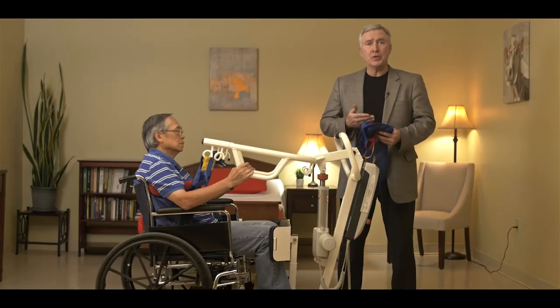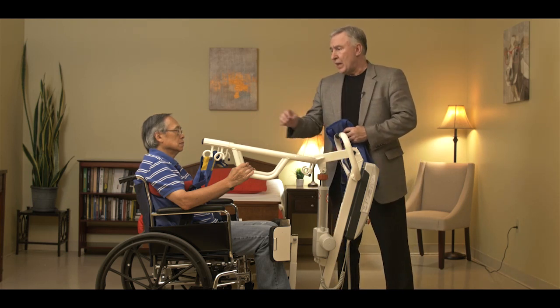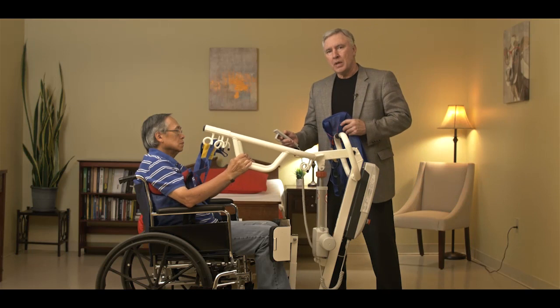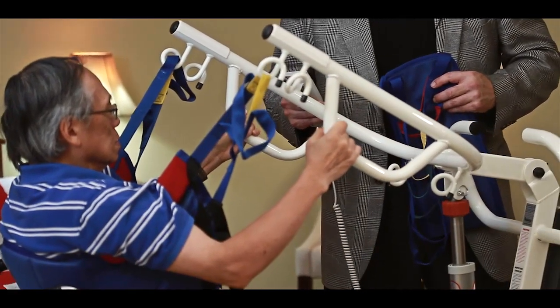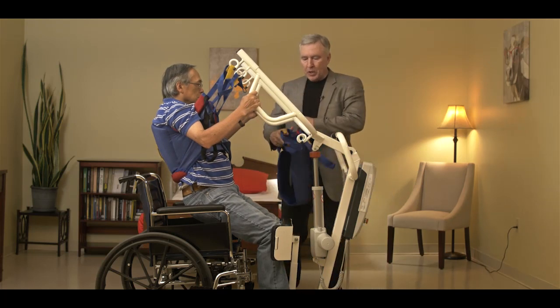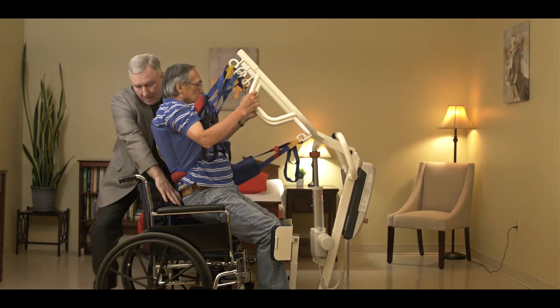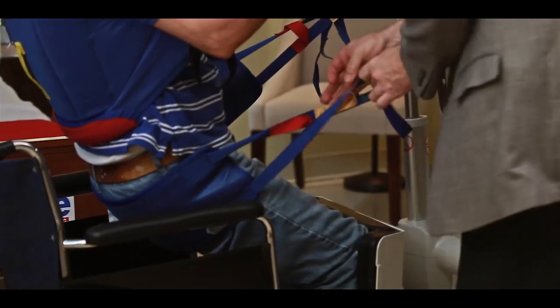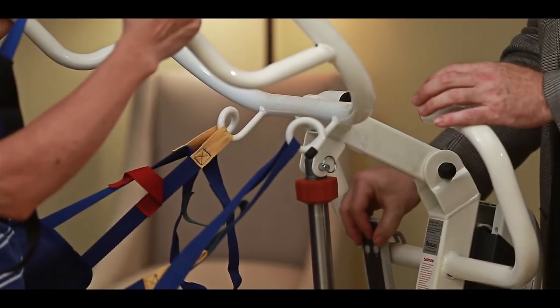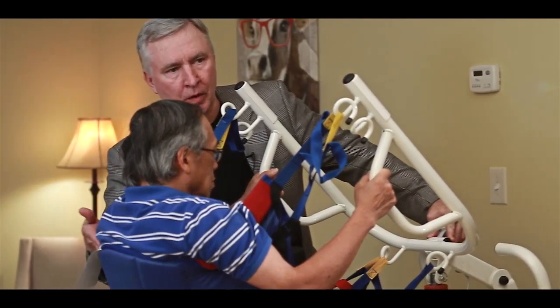Now it's time to show you how to use the buttock support strap with the SA family of sit-to-stand products. Our patient is in the lift with the standard support vest behind their back. This product is designed to provide additional support if the patient has a tendency to slide down through the sling during the transfer process. The buttock support strap connects to the first set of hooks, and has multiple loops to adjust the length. We bring it around the bottom and connect it to the other side. With this additional support, we can minimize the possibility of the patient sliding down in the sling.